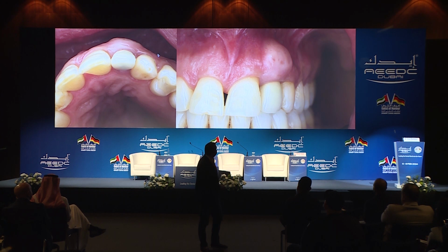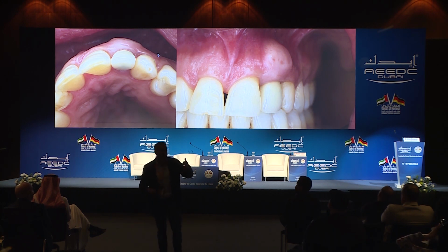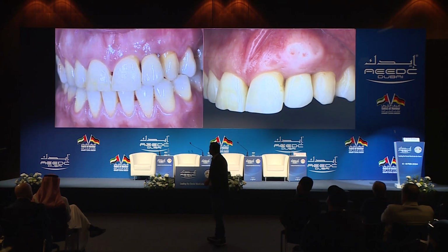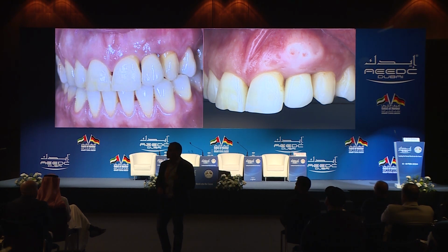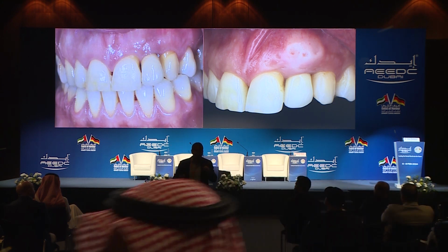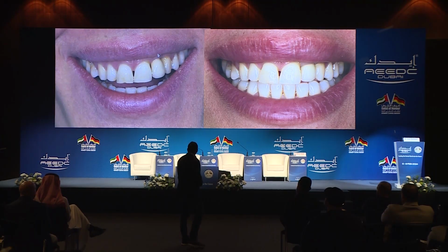The implant's still there, but she has a pregnant gingiva. So if anybody here has a recession and wants a graft, I have a good donor for you, all right? This thing keeps on growing. I have many cases like this after 10 years, really, it kept on growing. So if you choose your connective tissue graft, don't choose the tuberosity for a gummy smile patient, because this will turn white. In these cases, probably better to choose a connective tissue graft internally from the palate with a thick one, rather than choosing a free graft that will turn white, and on a gummy smile patient it is not really fun. And this is her smile before and after.